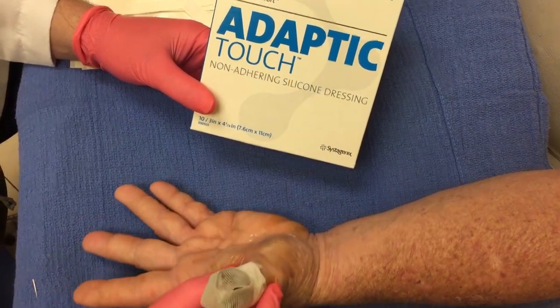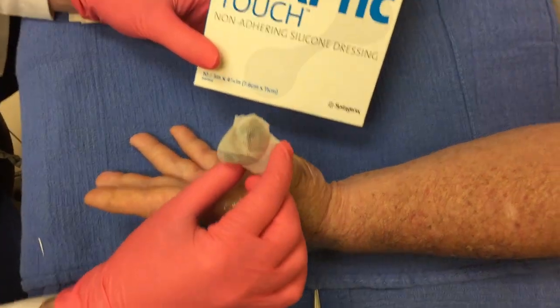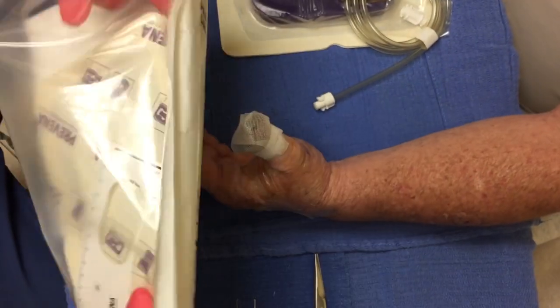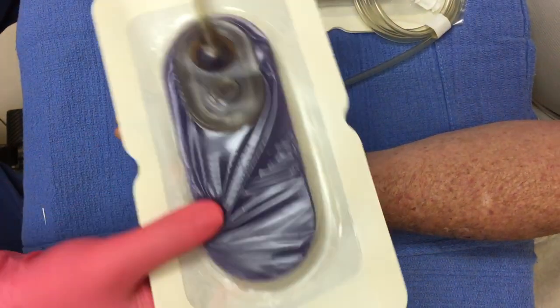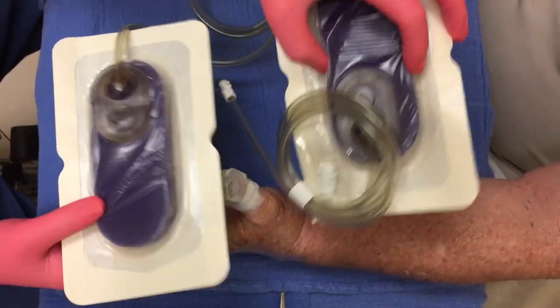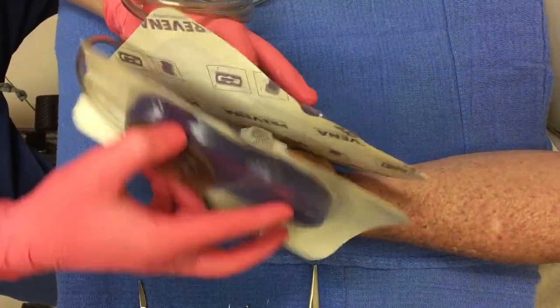Now we have it secured over our skin graft, and then we can put the Praveena wound dressing back over that. We have the Praveena dressing — inside of it is the purple Praveena sponge you can see here. I have two of them, and we are going to place the two of them like a sandwich, just like this.